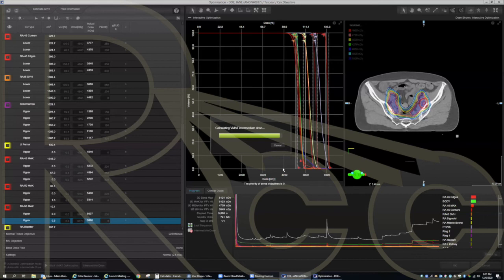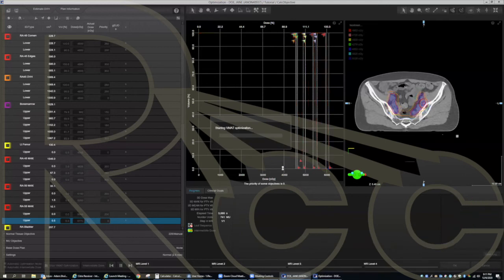So you pick up things from different planners. I think the idea is to try to be as efficient as possible and as high quality as possible. And methodical, when you know exactly what you're changing and when you're changing it. So it can get confusing though. Yeah.